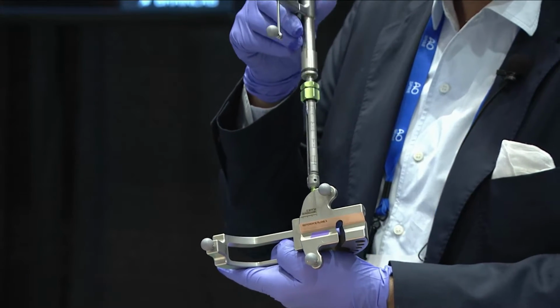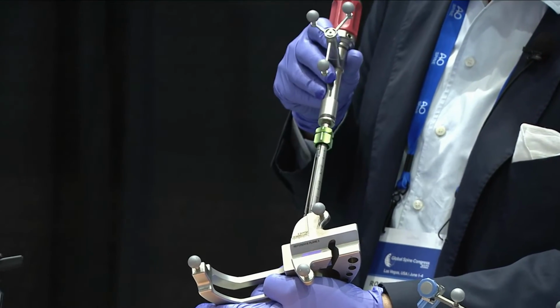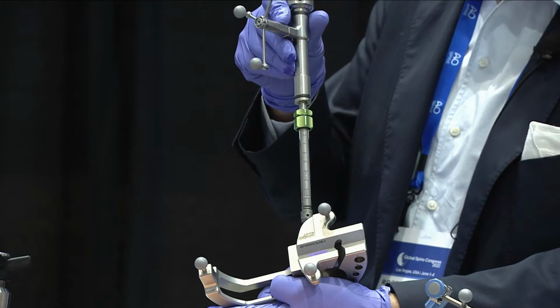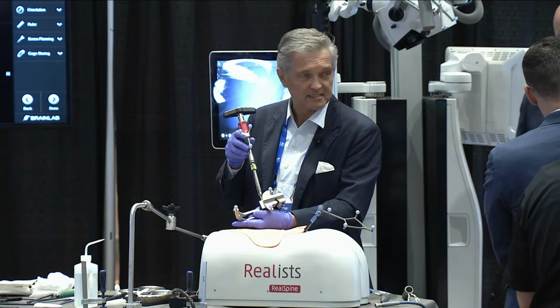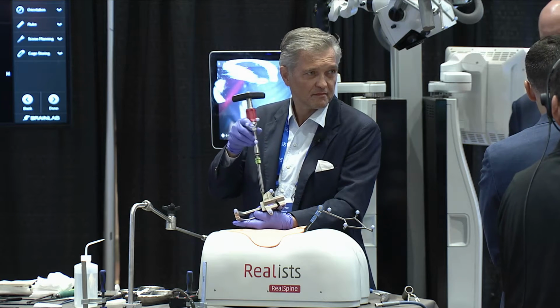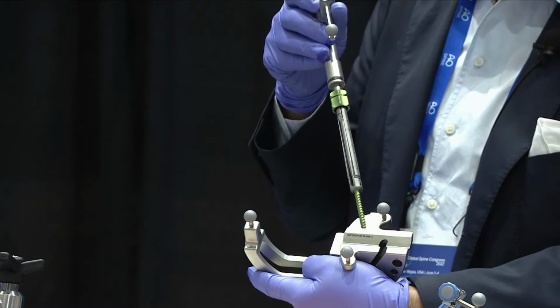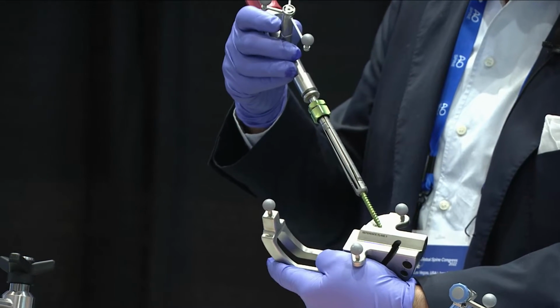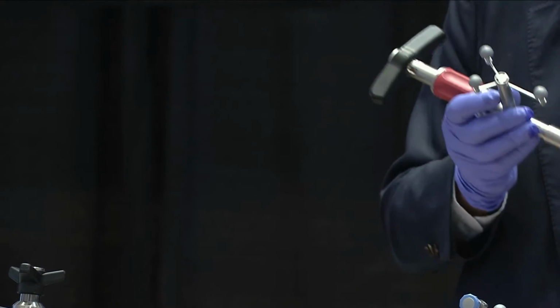One question, Dr. Harto. Yeah. Do you like drilling the entry points in MIS case for the screws? It's not necessary with this system. Yeah, it's not really necessary, and I'll show you. You can, and this is just to confirm the accuracy there. So this is nice and accurate. I'll give that back to you.